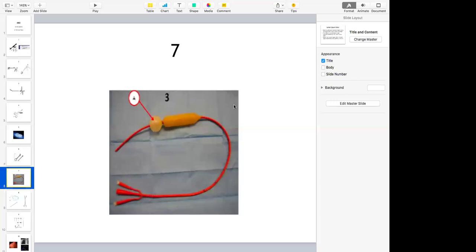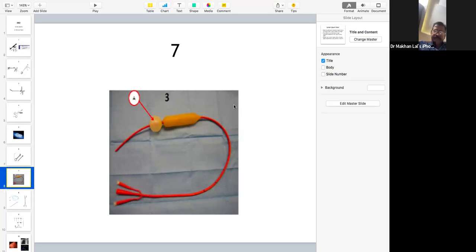Now, what is the clinical use of this? It is used in a patient presenting with variceal upper GI bleed with hematemesis. So you apply tamponade with this, and then what do you do? What is the definitive management following this? Medical management and upper GI endoscopic control of the variceal bleed. So what are the procedures available for controlling variceal bleed through endoscopy? Sclerotherapy.